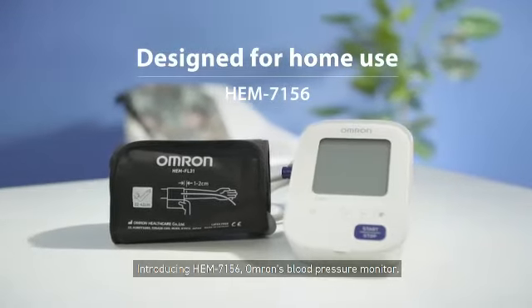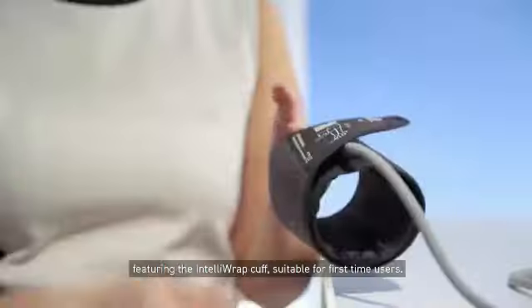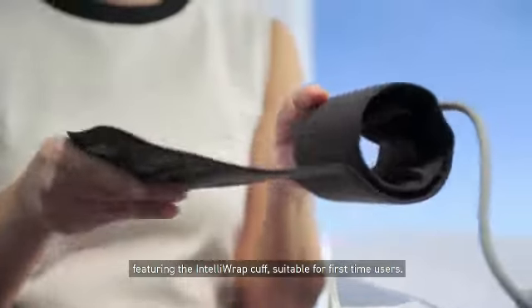Introducing HEM 7156, Omron's blood pressure monitor, designed for home use. Featuring the IntelliWrap cuff, suitable for first-time users.